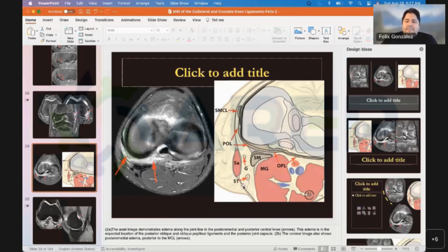How long does it take to image the whole set of these images for knee injury? Usually about 25 to 30 minutes. Okay. Next question is about the treatment.